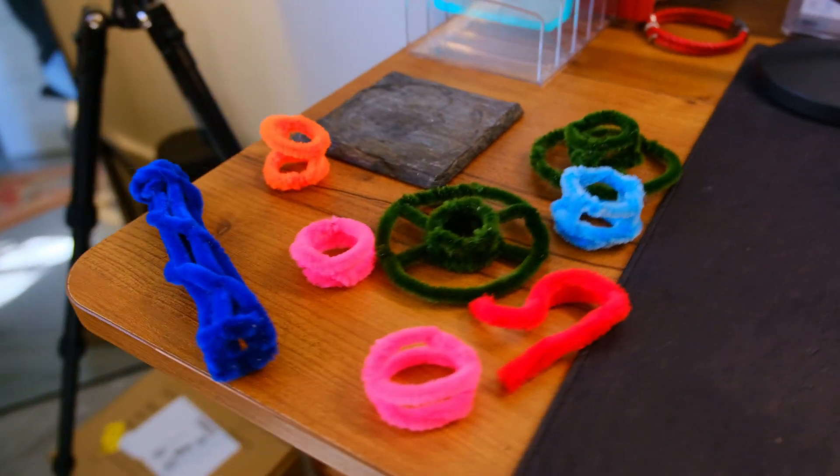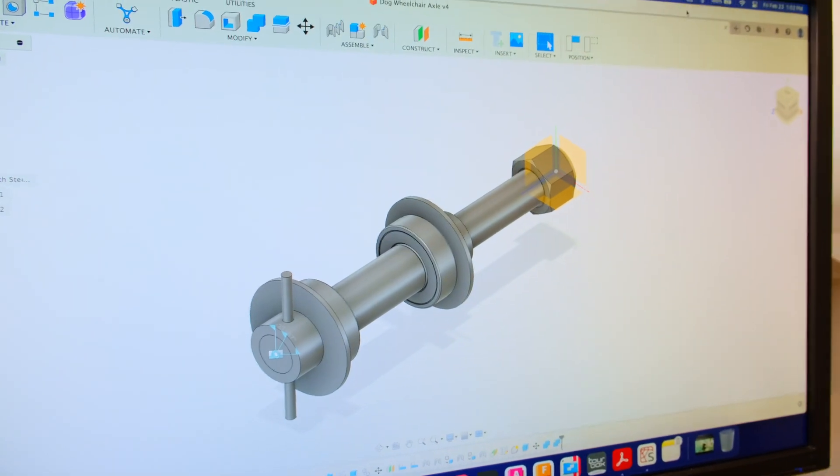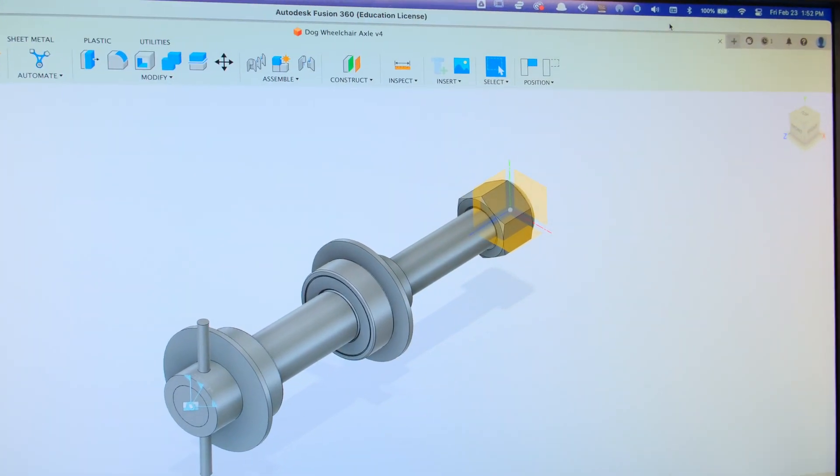This also makes sure that when needed the spacer can come off so that we can replace the wheel with ease. Hold on to your seats because we're not just playing with arts and crafts here. Here's our CAD model of the axle — this is where design leaps from imagination to digital reality, showcasing every precise detail that's going to give Mindy the freedom she deserves.